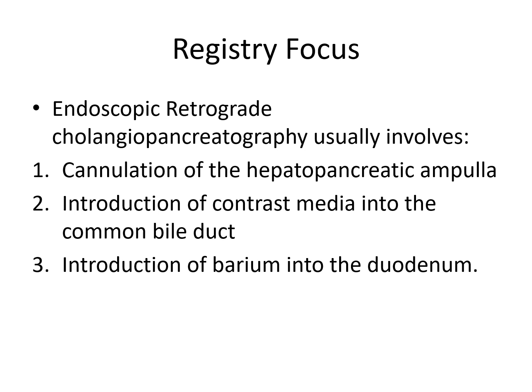Which happens during an ERCP? And if you said 1 and 2, you would be correct. We do not inject barium during an ERCP. Okay, you'll do that during an upper GI or a small bowel follow through, but you won't do it during an ERCP.